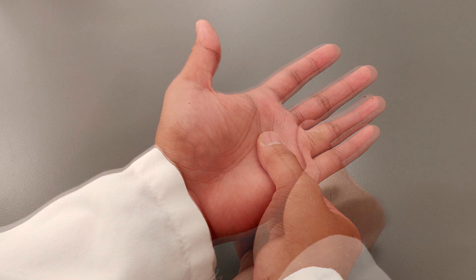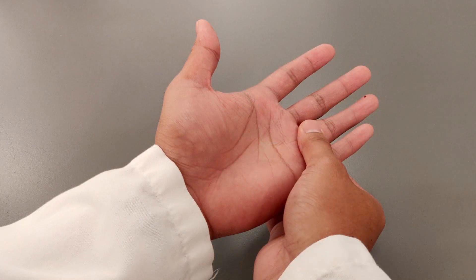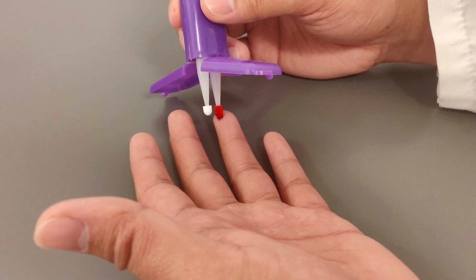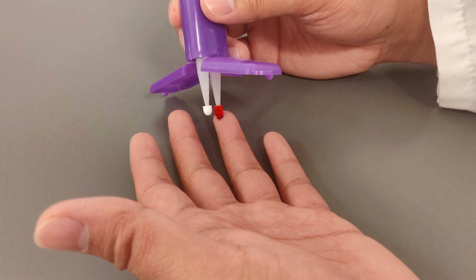When this happens, massage from the palm up towards the finger and wait for another blood drop to form. Try again until the sampler tip is fully red, count two additional seconds, and then remove.